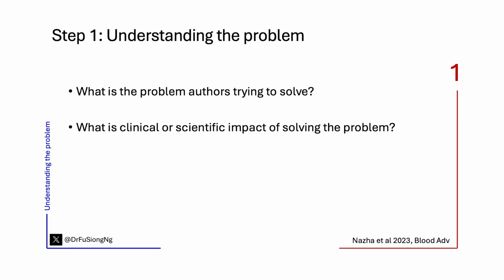Like any paper that you read, if you read a clinical trial or an RCT, you need to first understand what is the problem that they're trying to solve and what is the impact of potentially solving it. That should be quite well defined in any paper on AI-ECG. The more important bit is then to understand what has been used to train the model. And for this you need to read the fine print, just as you do when you read a clinical paper and you try and dissect out the pros and cons in Journal Club. You now need to learn to do this for AI-ECG.